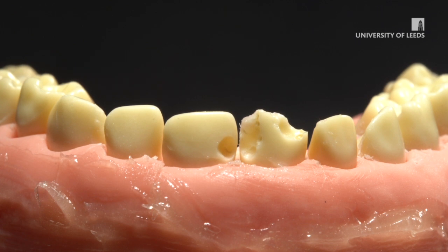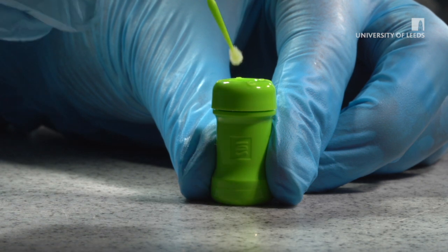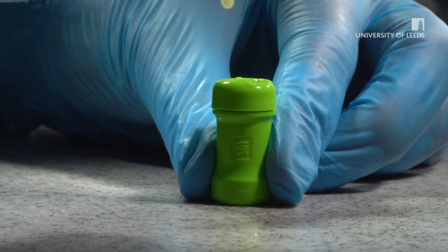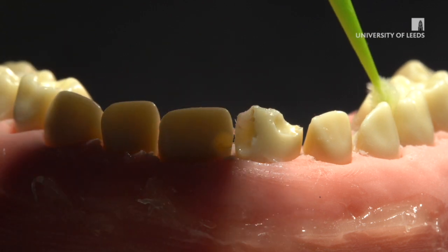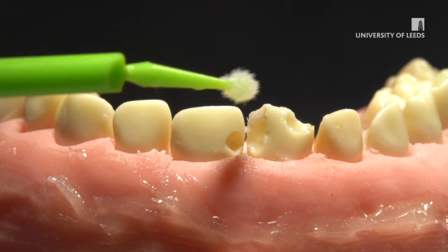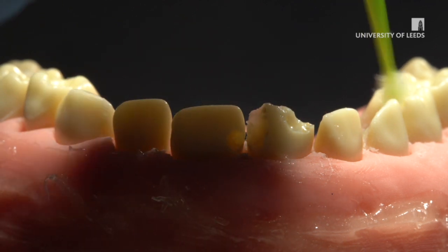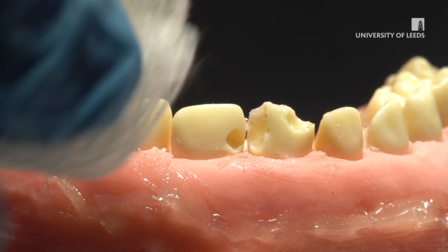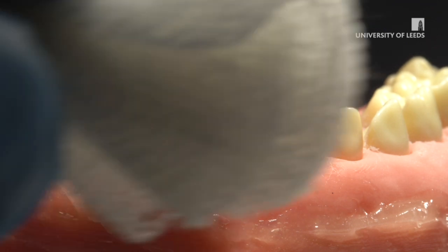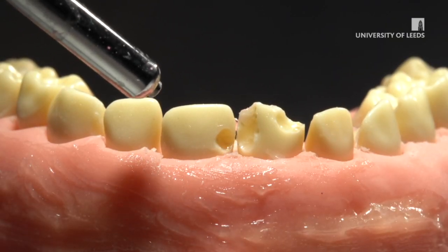After that, if you decide to use the potassium iodide, grab one green capsule of potassium iodide, pierce it open with the green brush, and apply it straight after the silver diamine fluoride until the white creamy material becomes clear. Please remember that for every patient, you can only use one capsule of silver diamine fluoride and one capsule of potassium iodide. Do not exceed the recommended dosage. After applying both, you have to dry the teeth — ideally for three minutes, but at least for one minute — either with a gauze or with three-in-one. After that, you will start to see that the dental caries is going darker in colour.